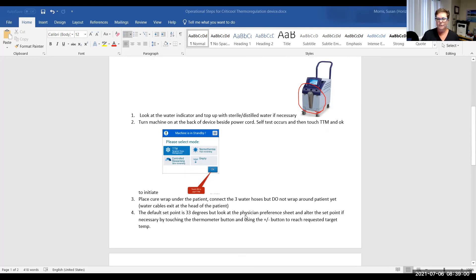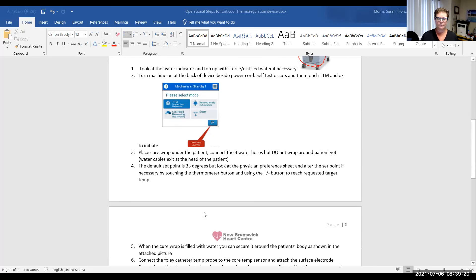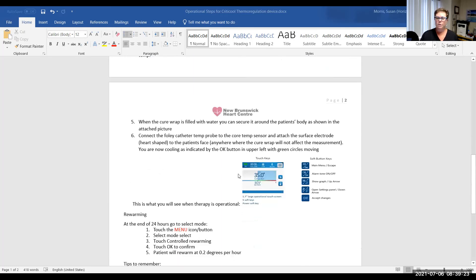And so our set point is 33 degrees. If that is not what your physician prefers, you're going to touch the temperature icon and add temperature that the physician requests. Most of them are at 34 now, but a couple of our physicians want 36.